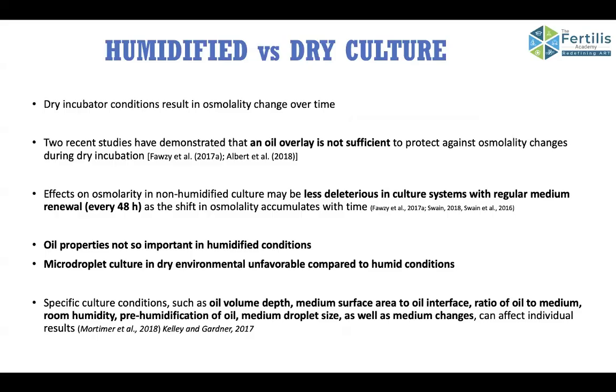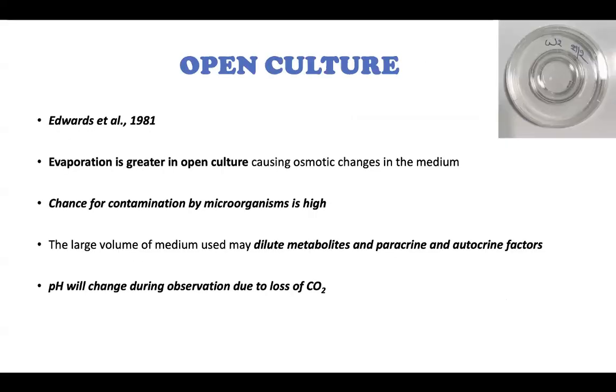When you talk about humidified versus dry culture, humidified is being preferred nowadays because the changes in osmolality and pH are minimal in a humidified culture compared to a dry culture, in which you have to maintain the right thick oil layer on top of small media drops. So the first baby was born in an open culture. Edwards did it. But again, the side effects are that the evaporation is much greater, the exposure to microorganisms and contamination, the penetration of VOCs, etc., is much more in an open culture compared to a drop culture. And it also dilutes the autocrine and paracrine factors.